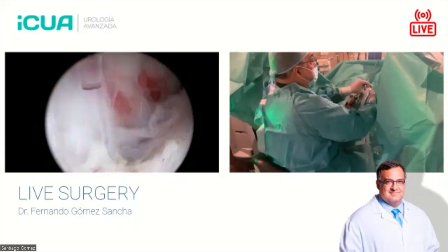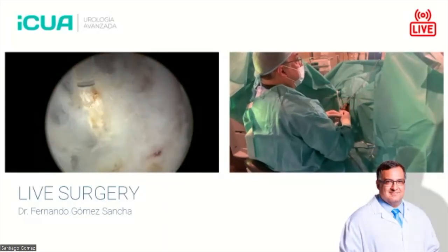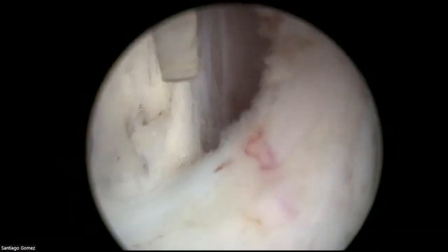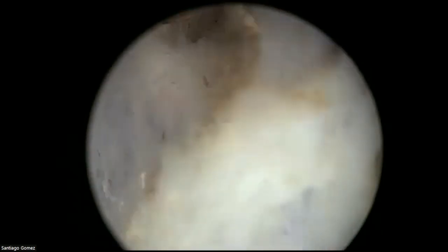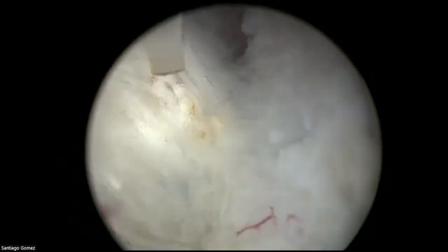Okay, so here, as you see, we're going around the prostate. It's a big one, 90 grams, not huge, but still it's giving us some work. And now I'm trying to follow my line. You see, I can follow my line. I'm trying to connect. Always try to connect your line. Try to go from your line in one place. And if there is some discrepancy, or if the line is degrading a little bit, you need to look after the line because the line will help you a lot.